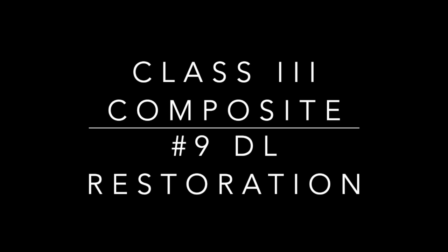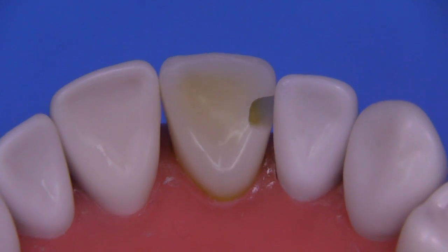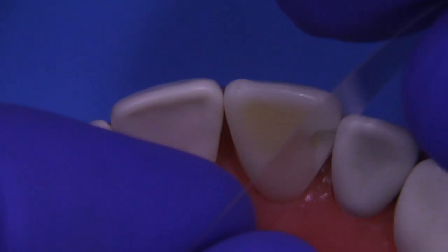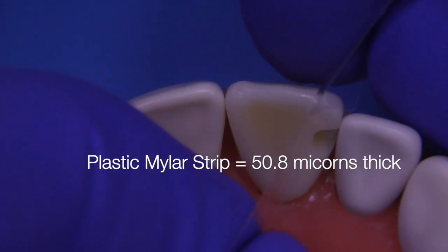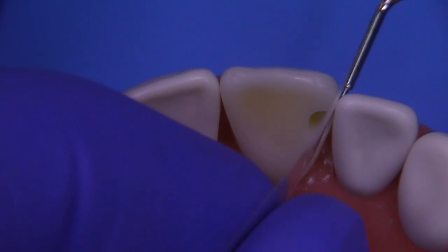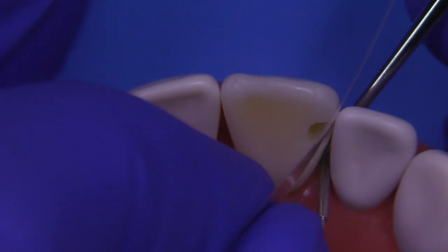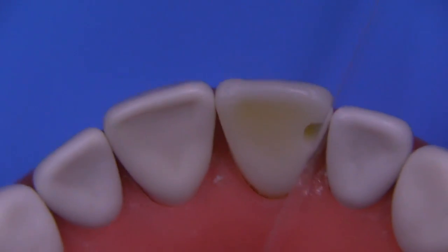Today, we're going to tackle the class three composite restoration. In the previous video we did the preparation on tooth number 9, DL. So let's start by inserting the plastic mylar strip, which is about 50 microns thick. This is thicker than a metal matrix band, so sometimes you need to create a little bit of separation by tweaking an instrument between the teeth and allowing the strip to seat all the way through the contact down to the gingival crest.